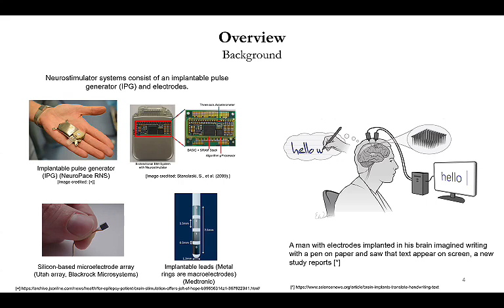In the right figure, it is another application with Blackrock Neurotech. Basically, one of the impaired patients is sitting there. If I remember correctly, he is an ALS patient.